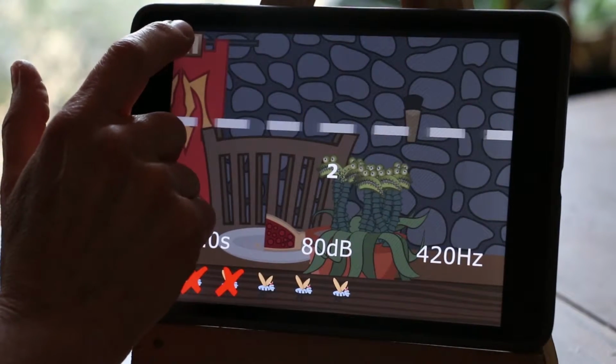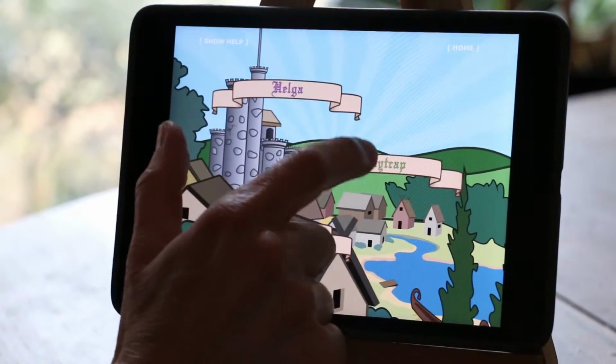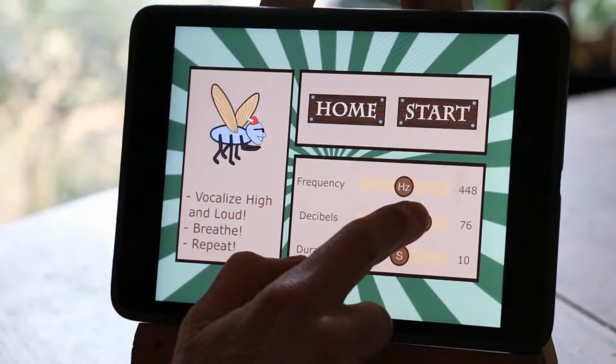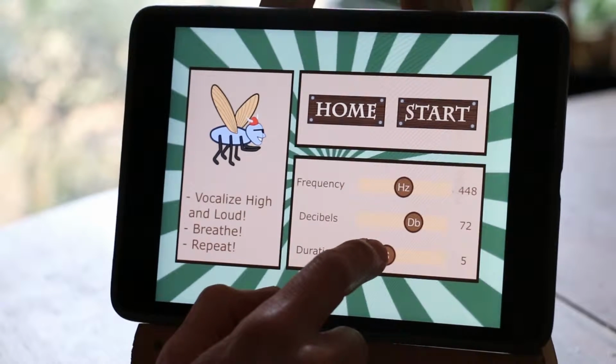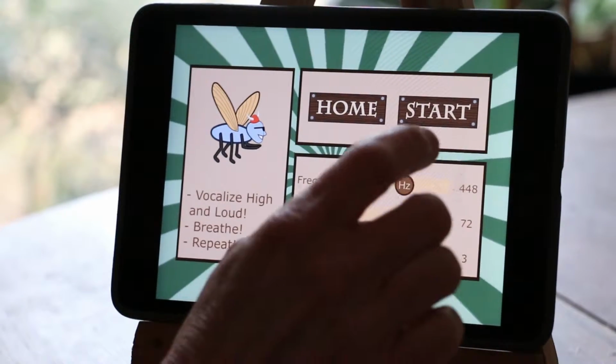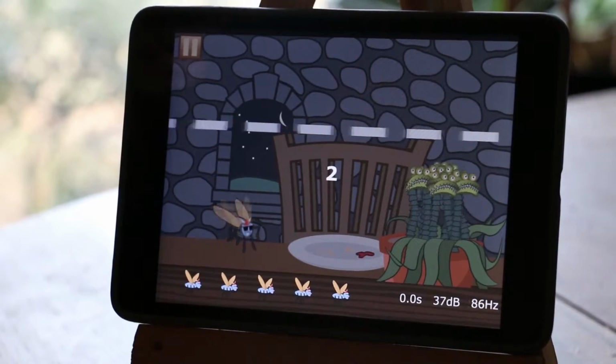The fly flies very low. The whole idea is to set the parameters at a place where you think the patient can succeed, so that they're exercising their laryngeal valving. Now we'll set things with the correct parameters so you can see successes. It's set up for you to complete 5 trials, and then you can readdress the parameters as needed.